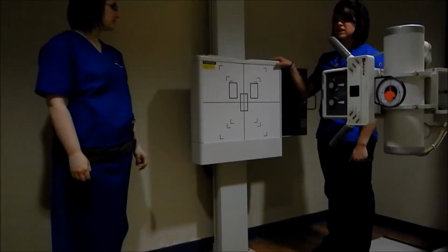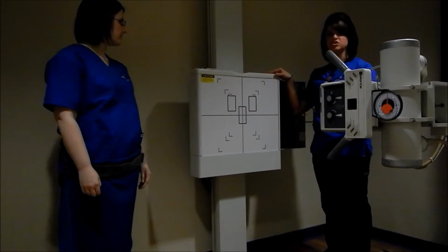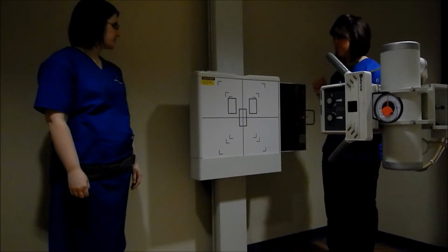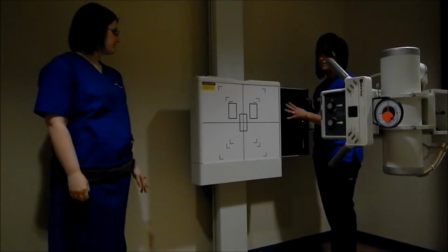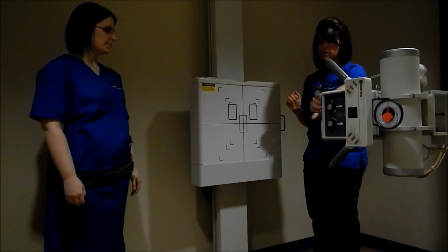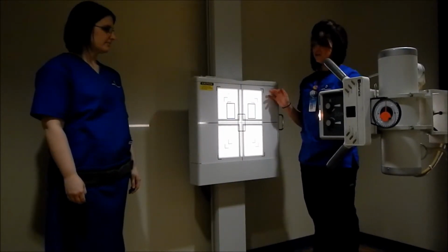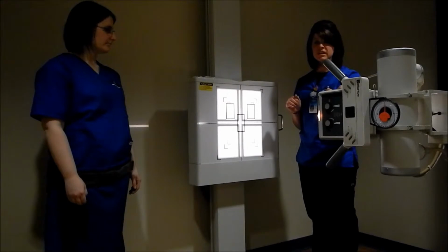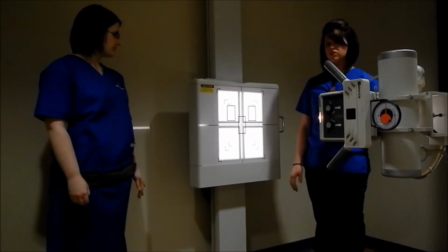For the next projection, we're going to do an AP upright abdomen. So you're going to want to change your tube around to use the upright bucky. You are again going to want a 14 by 17 lengthwise cassette. You're going to want to line your bucky and tube up for a 40-inch SID, and make sure it's in detent and everything's aligned before you bring your patient over.